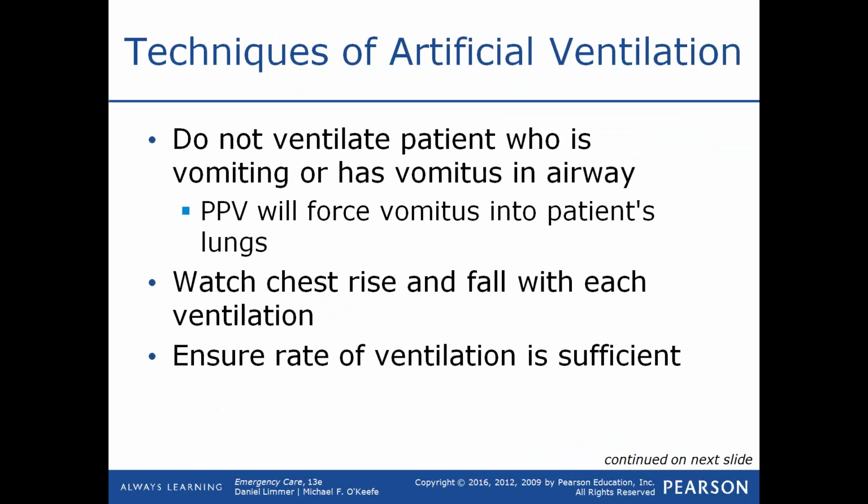I know I'm ventilating my patient enough. I know I'm providing enough tidal volume because I see the chest rise each and every time I squeeze the bag. And then I want to make sure that I'm ventilating them at an adequate rate. If the patient is short of breath, they may be ventilating shallow at 32 times a minute. Well, if I'm assisting their ventilations, I don't want to match every breath. Otherwise, I would be ventilating them at 32 times a minute, and that's way too fast.